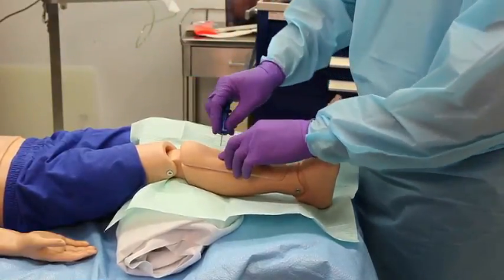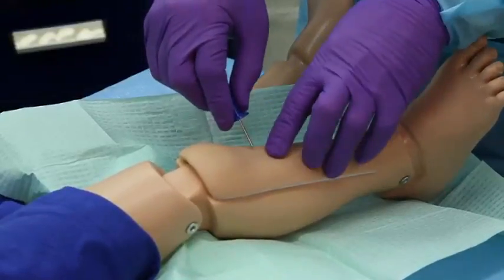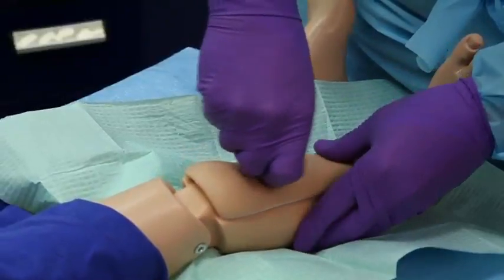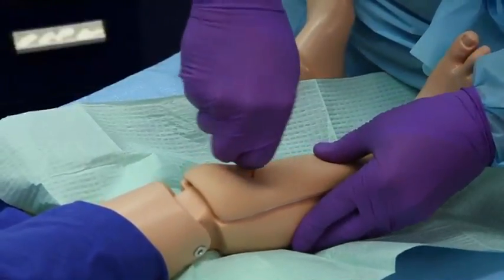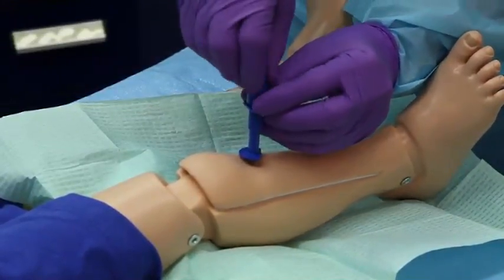Aiming away from the epiphyseal plate, introduce a short-threaded or smooth large-caliber bone aspiration needle with the bevel directed toward the foot. Using a gentle twisting or boring motion, advance the needle through the bone cortex into the marrow.